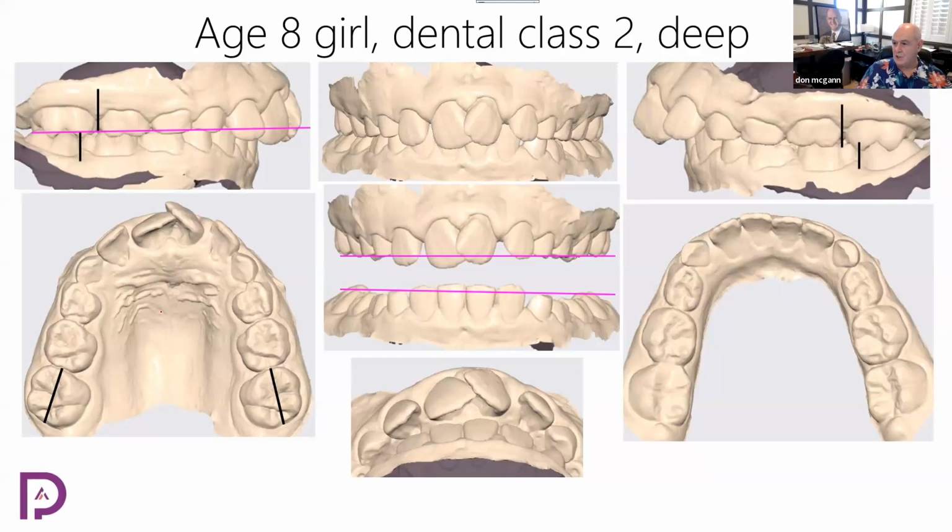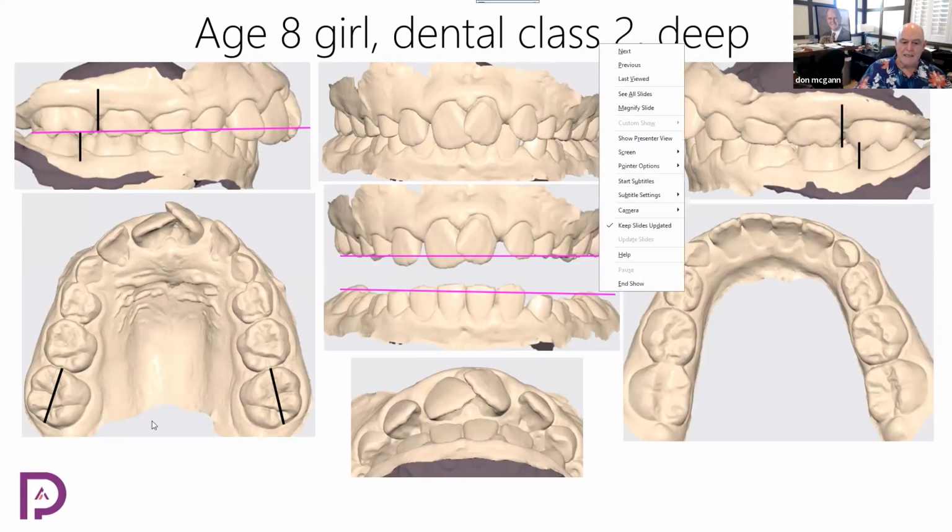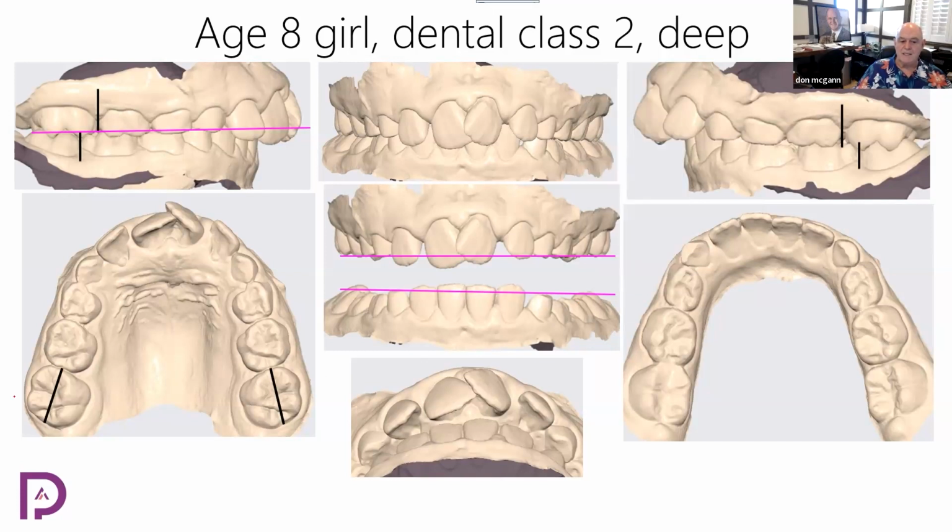Now we are next going to look on the lingual to see where the palatal cusp is, because that changes according to the molar rotation of the upper. So if the upper molar is rotated mesial palatal, from the buccal it looks like it's class 2, but from the palatal it's class 1. That is a favorable case. So I see some mesial rotation of the upper molar. Do you see that? It's not a lot, maybe 10 degrees, but that 10 degrees can be very important. I'm going to show that to you in a minute.